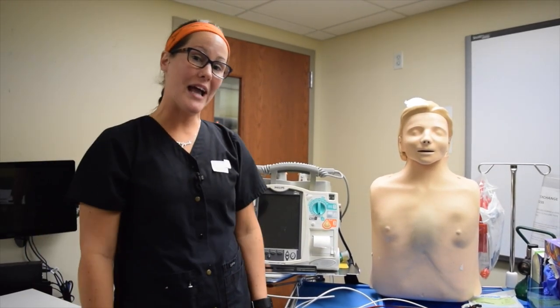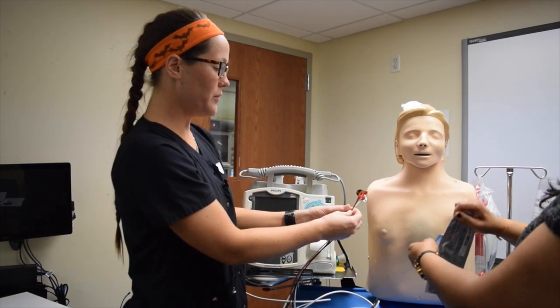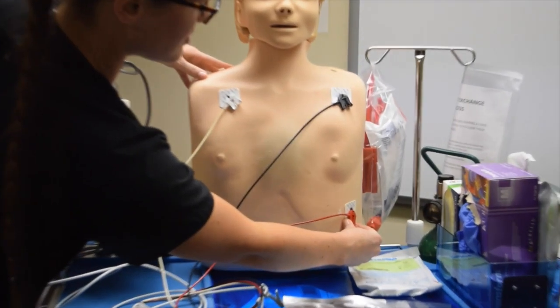Now we'll demonstrate how to place the ECG wires on. When you place these on the patient's chest, white is on right, black will be on the left upper chest, and the last one is red that will go on the left lower chest.